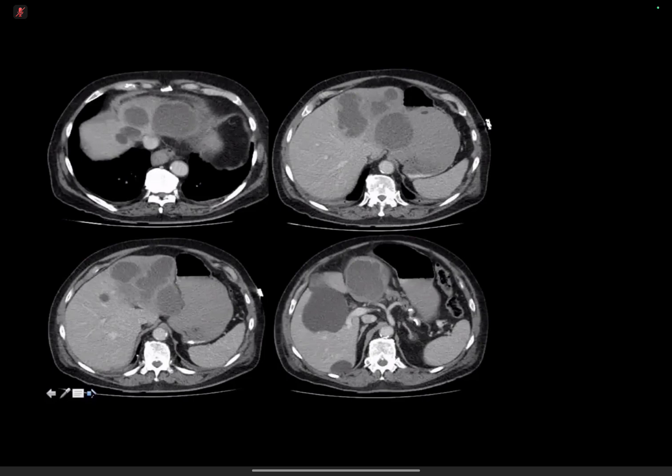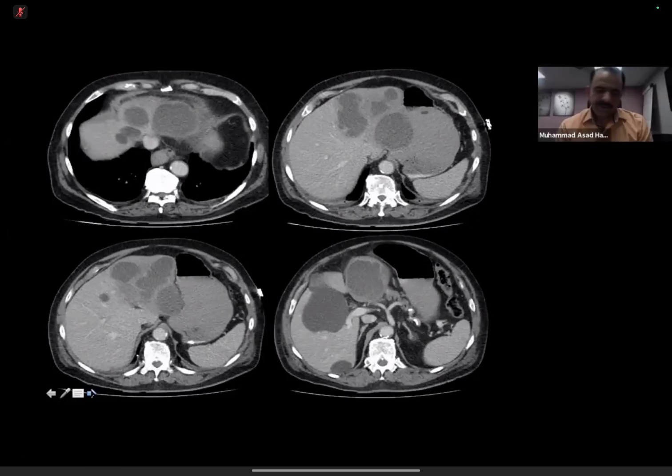I would want to evaluate the clinical presentation of the patient. If this patient has presented septic with fever, I suspect these might represent hepatic abscesses, multifocal. I mean, you're entitled to ask the examiner whether the patient has presented septic or not, because then that will narrow down your differential.